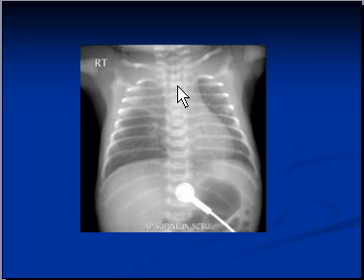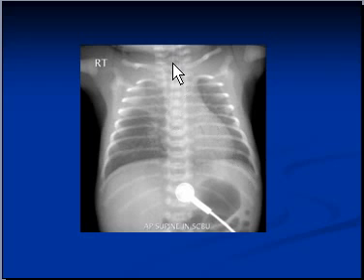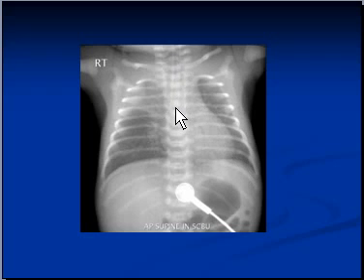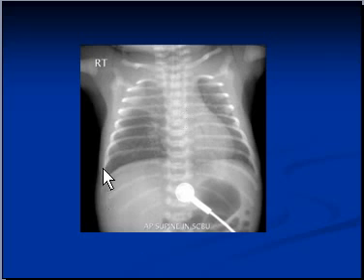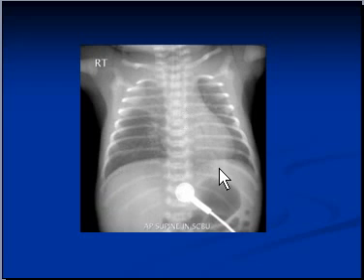Notice the patient is not rotated, and the endotracheal tube is projecting over the cervical and thoracic spine and is almost in the middle. Both diaphragms are nice and crescent in shape.